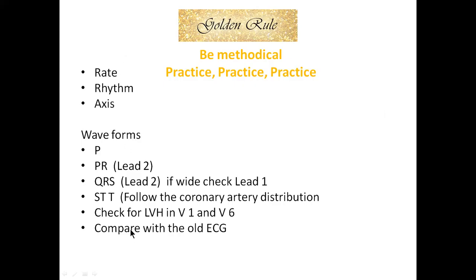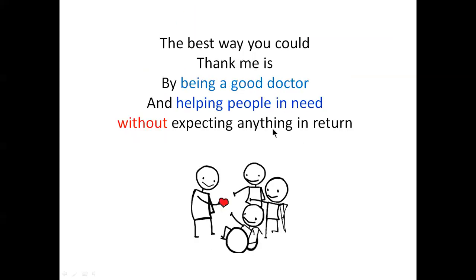So this is the sequence, and please write this down, keep it with you, and whenever you get an ECG, check this. And the more you do it, the quicker and better you will become. Hence the reason you need to practice, practice, practice. Okay. And always remember to compare with the old ECG. That's how you will know whether there are new changes.